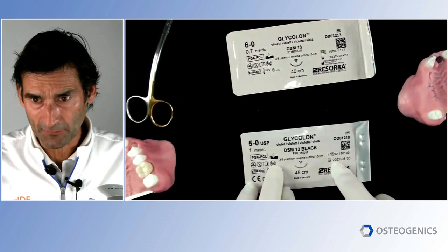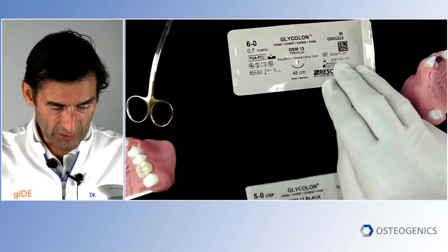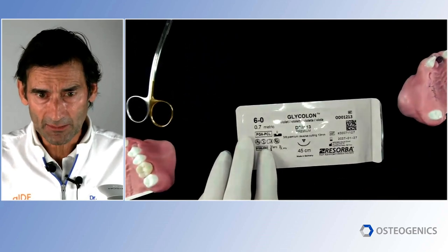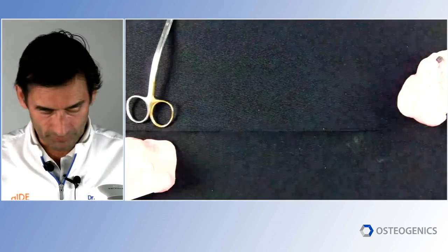And this would be a great one for mucogingival work, like the work I just showed you, or in a full arch case underneath a hybrid prosthesis. And of course, you can go also smaller in size, so you can see a 6-0. But again, remember, the thinner you go, the more you have problems with this possibly breaking through.